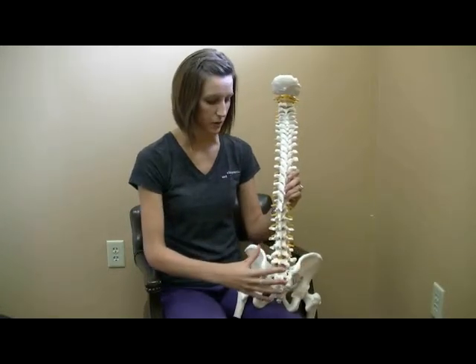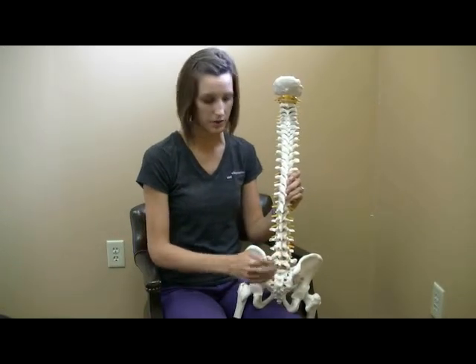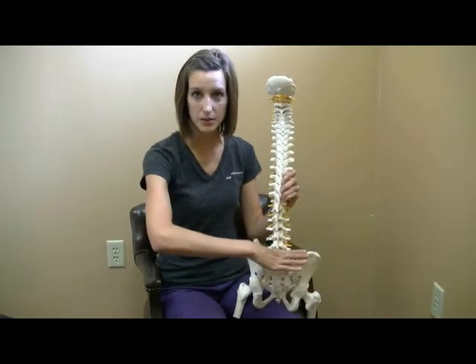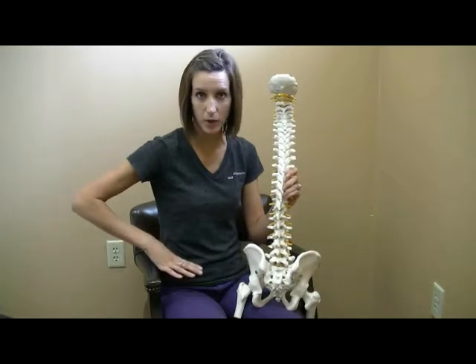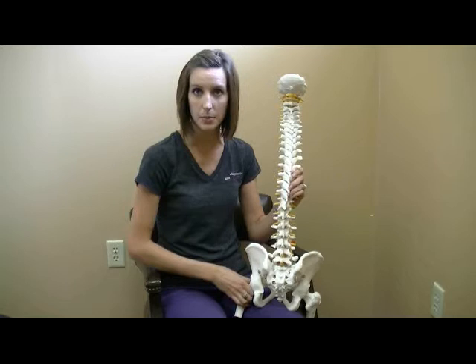From this view, we're looking at yourself here back to front. We should see on an x-ray that everything is straight up and down at the spine. It should be level across the pelvis and hips, which to you would be your waist area, and then level across the hips, actually the legs as they come into that pelvis.